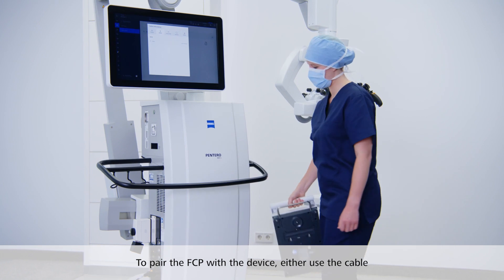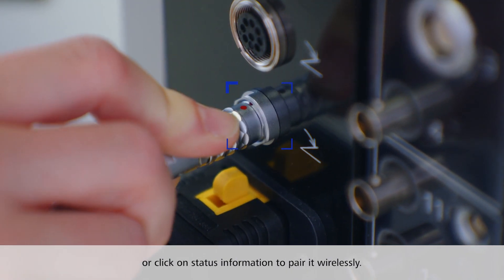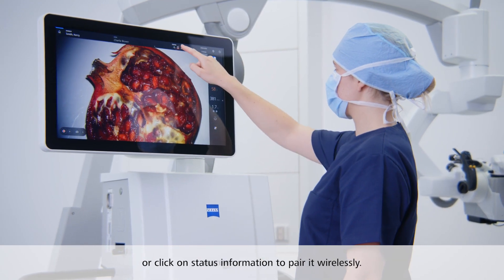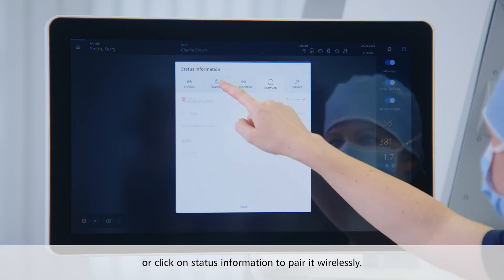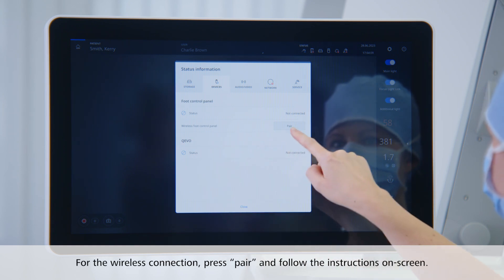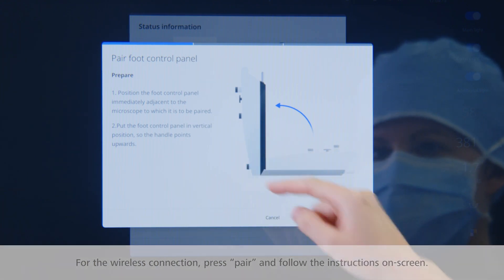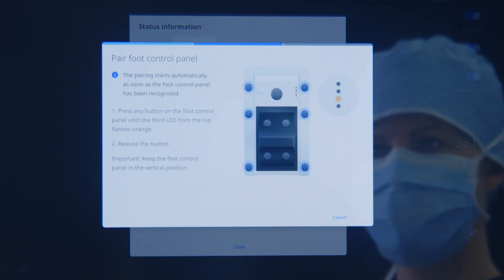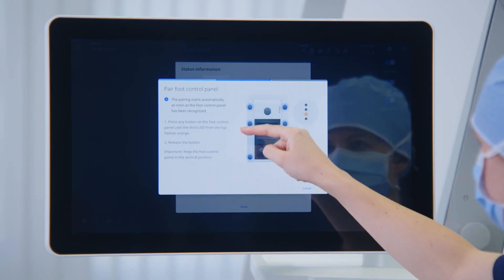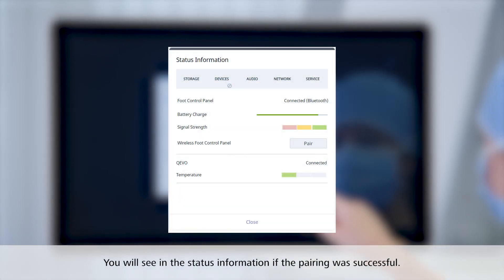To pair the foot control panel with the device, you can either plug it in with a cable or click on status information in the home menu bar to pair it wirelessly. For the wireless connection, press pair and follow the instructions on screen. You will see in the status information if the pairing was successful.